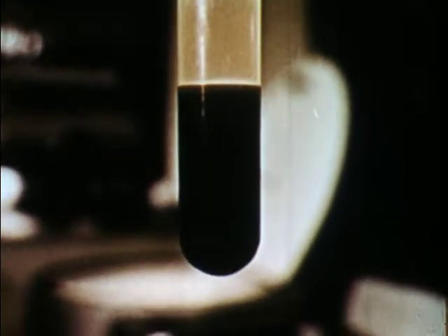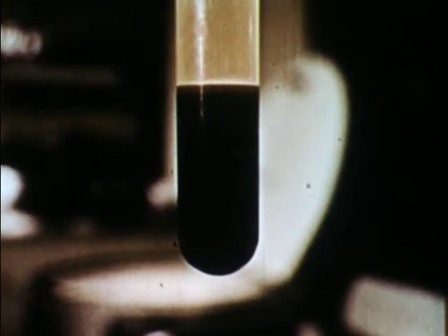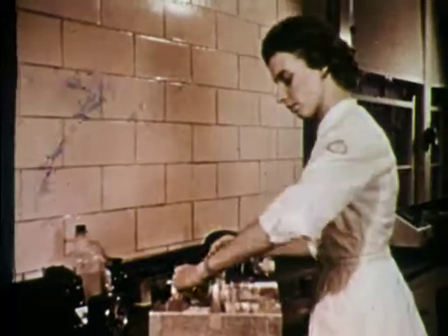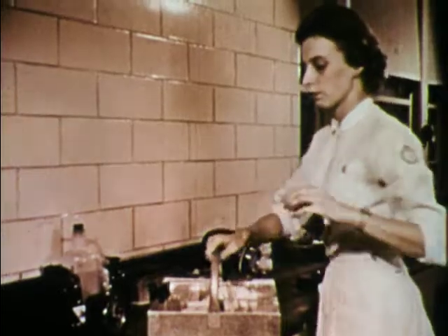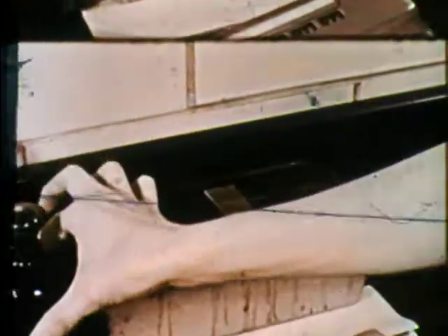The red blood cells make up about 45% of the blood's total volume. The narrow, cloudy layer just between the plasma and the red cells contains white blood cells and blood platelets and represents about 1% of the total volume. We can study the structure by preparing a smear on a microscope slide. Treating this smear with a stain makes the blood cells easier to see.